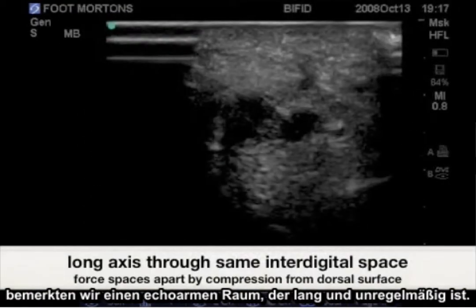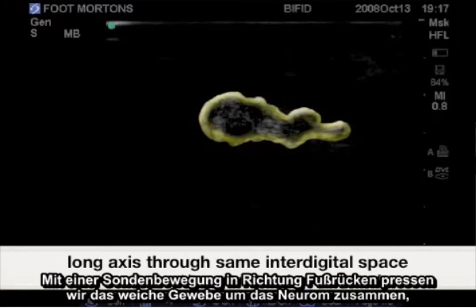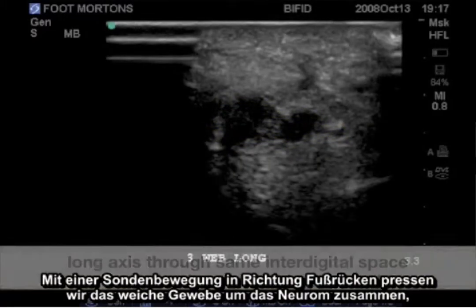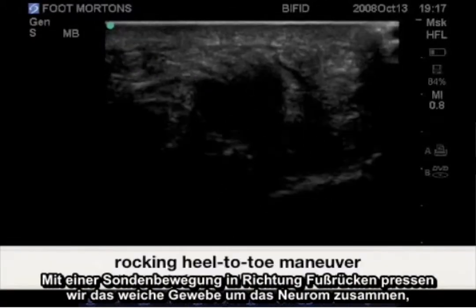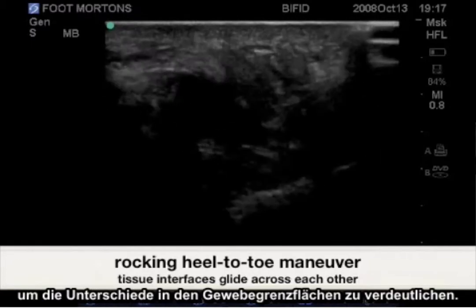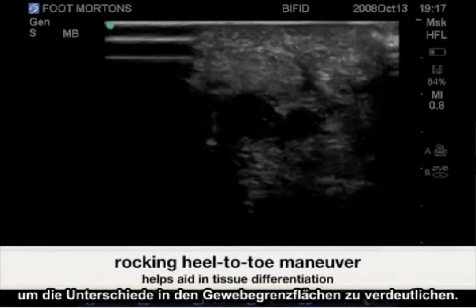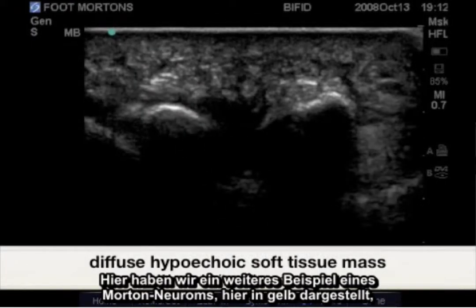Turning the probe to a long axis direction, we notice the hypoechoic space is long and irregular. Using a heel-to-toe maneuver with the probe will compress the soft tissue surrounding the neuroma to further bring out the differences in tissue interfaces.